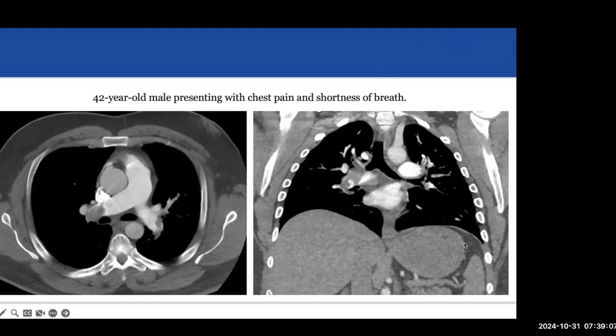Yeah, in terms of workup, first we did CT angio. I would need to establish the classification or grading of the embolism, whether this is massive, submassive, or mild form. But given the clinical picture, it's not mild, either massive or submassive.